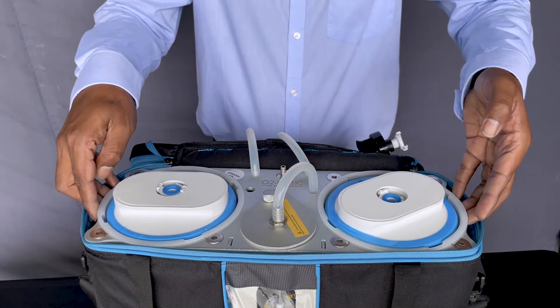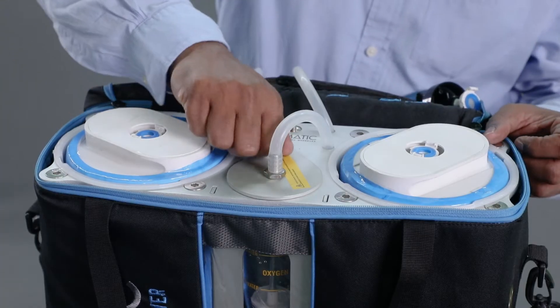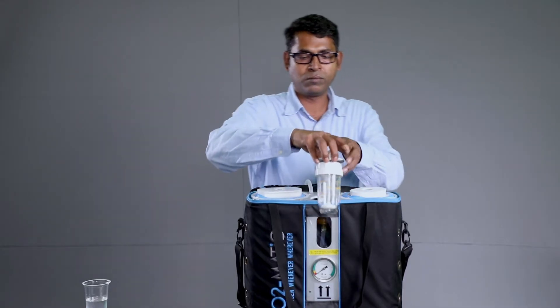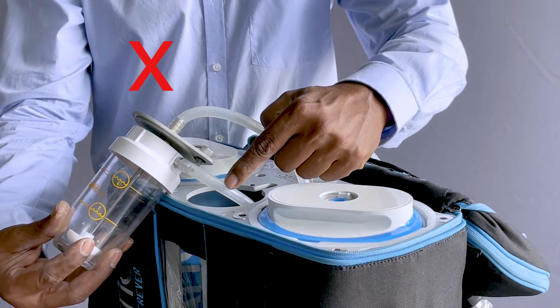Warning! Do not ever lift the main kit out of the bag. Unscrew the humidifier cover knob and lift the humidifier out of the kit. Warning! Do not ever remove the connected tubes.